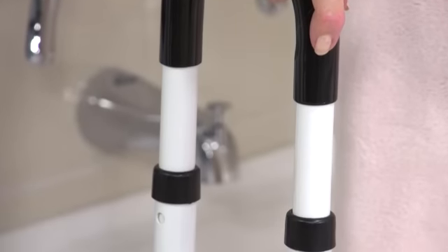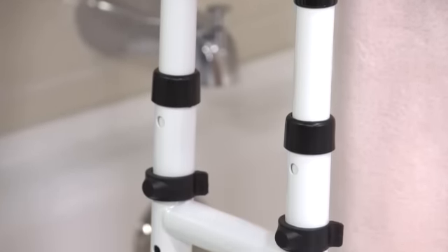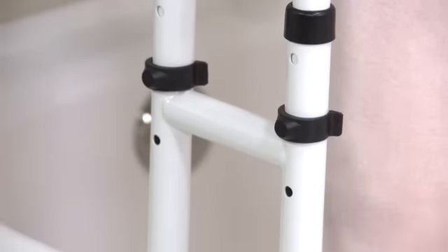This padded curved handle makes it easier for users to get a secure grip, even with wet hands, and the steel frame is durable and easy to clean.